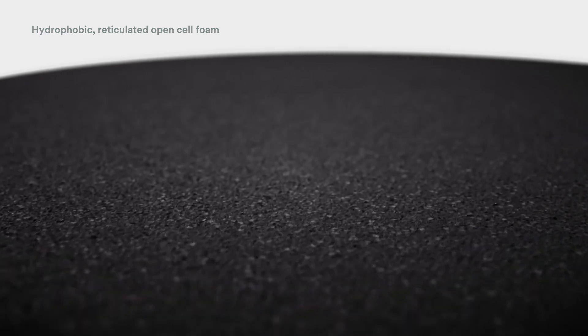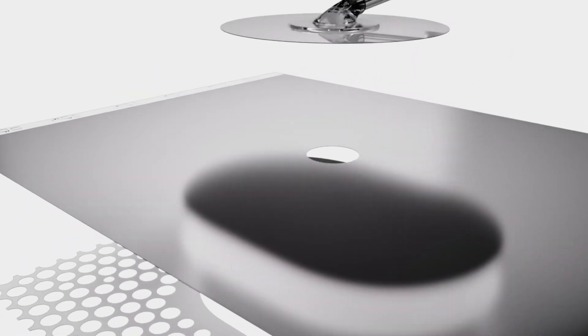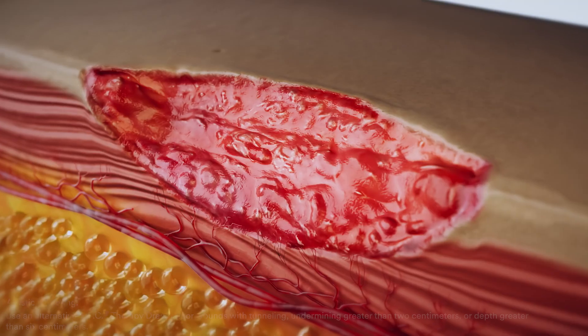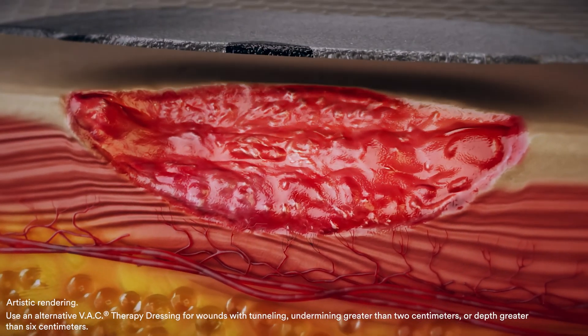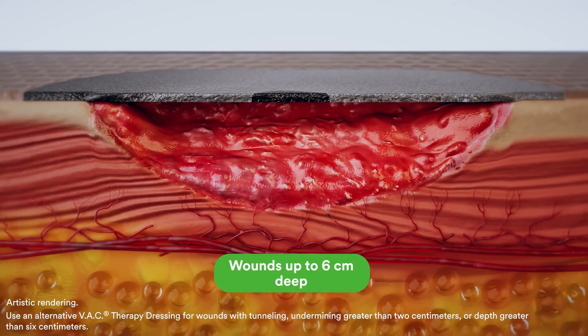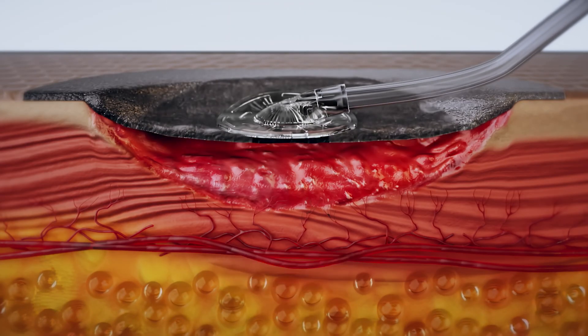The thin foam conforms to the wound bed without the need for foam fillers, uniformly distributes negative pressure, and allows for effective fluid removal. The top layer of the drape comes with a pre-cut hole for easy and more consistent application of the 3M Sensatrac Pad. Once negative pressure is applied, the VAC Peel-in-Place dressing easily conforms to wounds up to 6 cm in depth that have less than 2 cm of undermining and no tunneling.